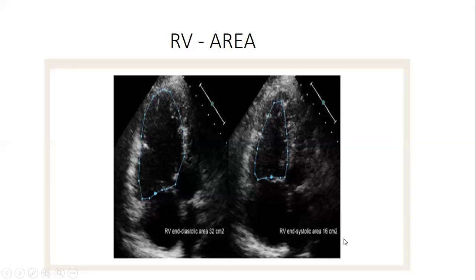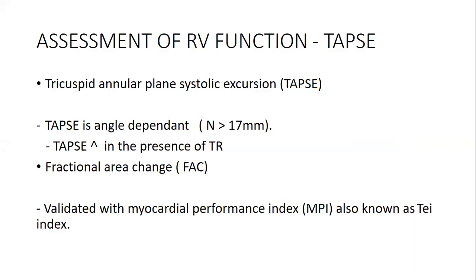What are we trying to say here? What are we trying to achieve here? We are trying to quantify the sizes, so that whatever we report, we've actually done it. Sometimes it's very tricky when you put measurements in your echo reports and you actually never did that, because you won't be able to justify exactly what you've written. So the point I'm trying to emphasize is that when a particular clinical question has been asked, you have to ensure that you comprehensively exhaust and do the standard work on that particular part of the examination that has been requested.